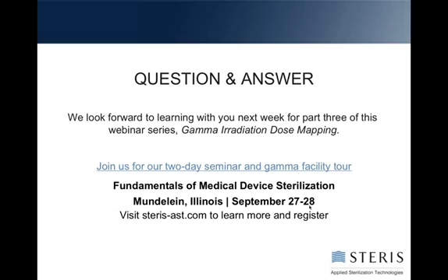I'll start handing over the technical questions to you. The first one is, which standard outlines the procedure for validation of method for bioburden? 11737-1.